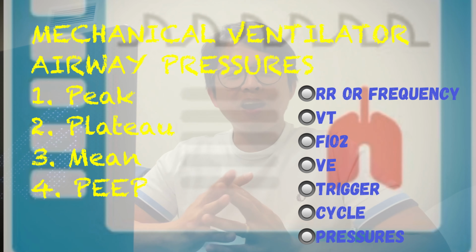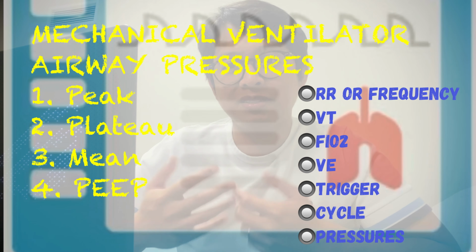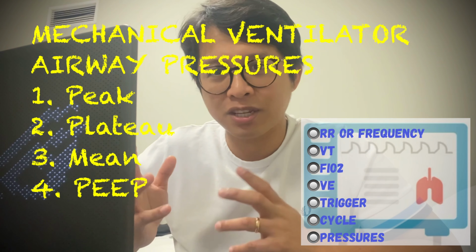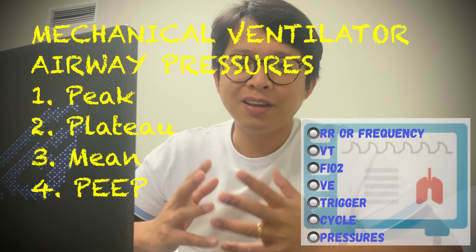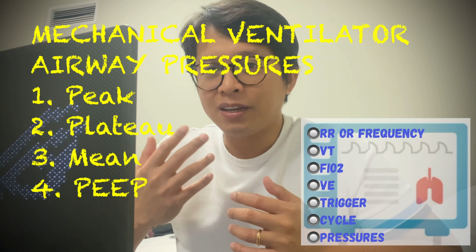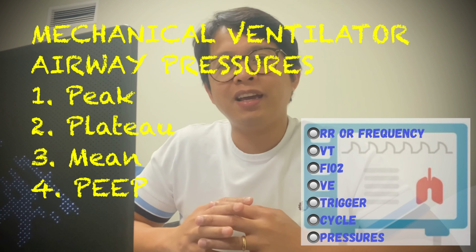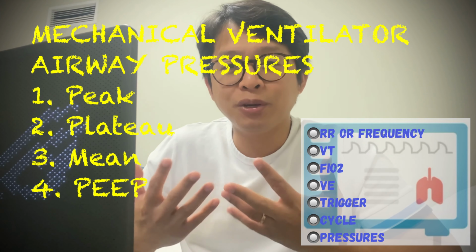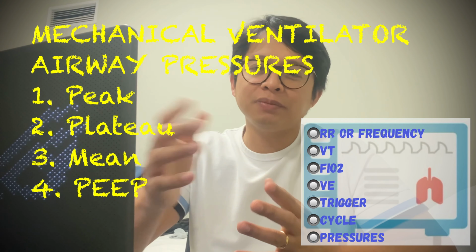It's like the average of your grades in a whole semester. The lower your marks in your subjects, the lower your general average is, right? The analogy is that the higher your peak pressure and the plateau pressure, the higher your grades. I mean your mean airway pressure.